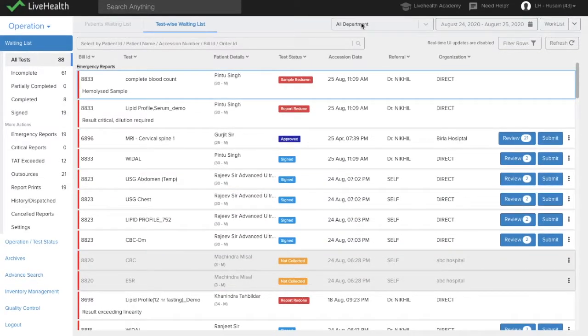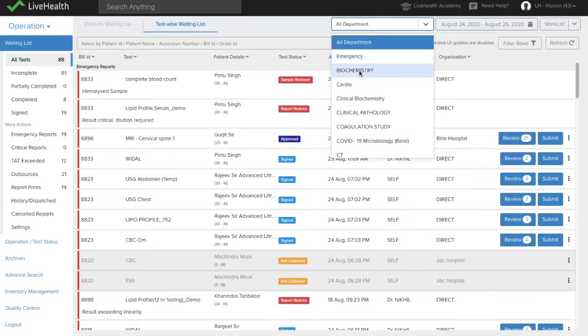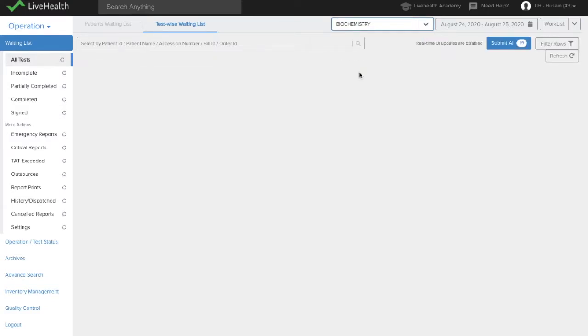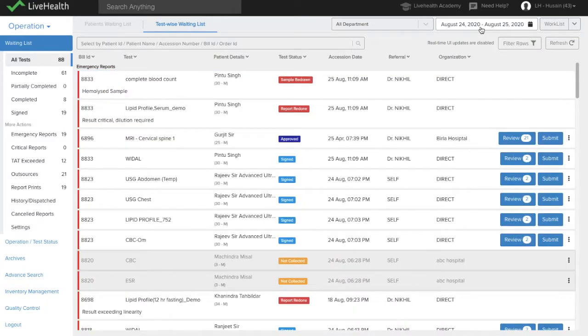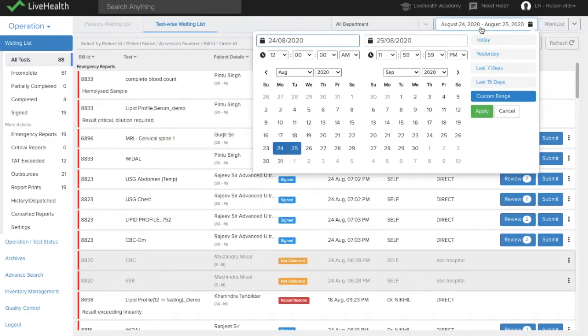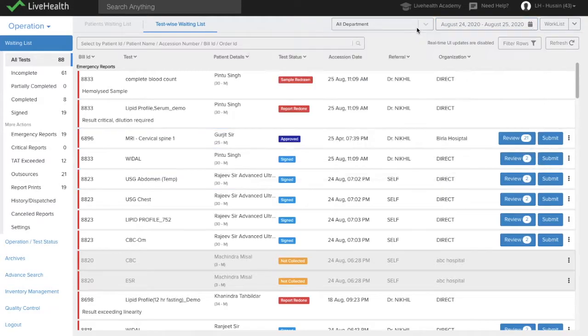Besides this, there are filters which allow you to choose which department you want to work in. So suppose if you work in biochemistry and only want to see biochemistry tests, then you can choose this filter. You can also use this date-wise filter to see the reports of patients which are in the waiting list across different dates.